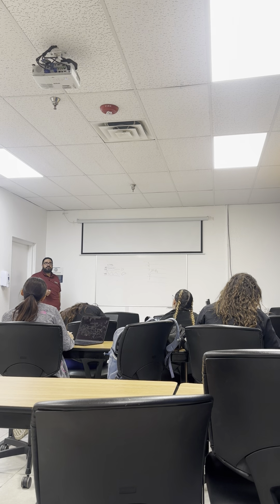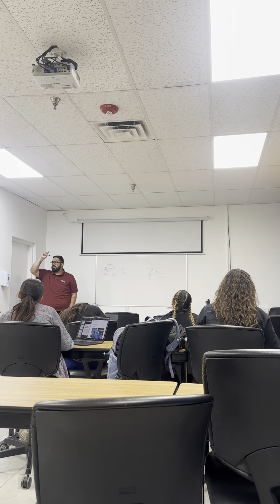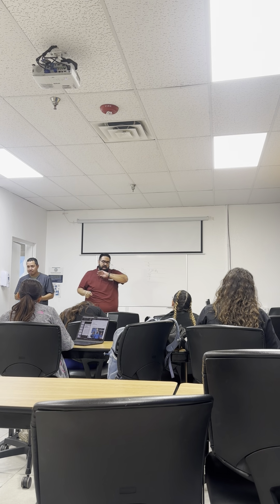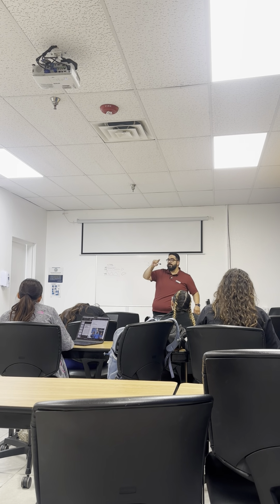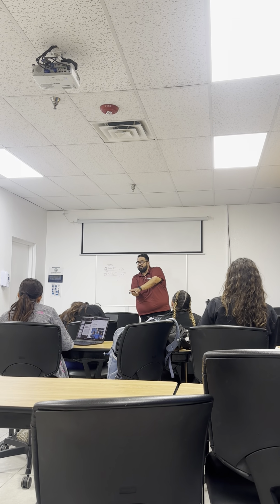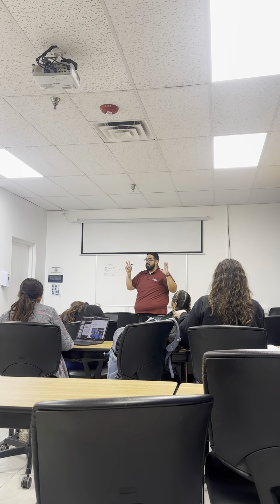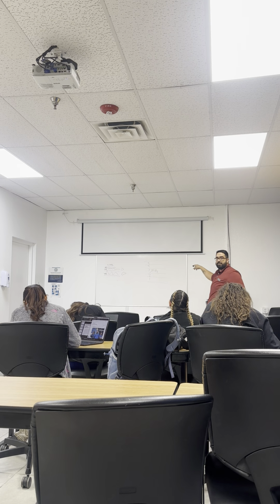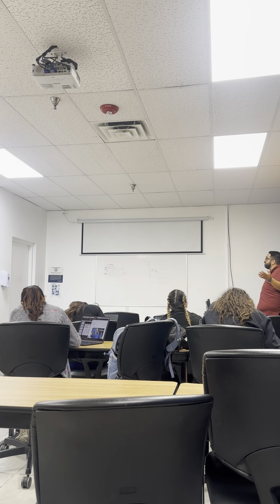Have you seen those artists where they draw, like, the old school, a line, and then they put that line aside, and then they put another color, and they put that one aside, and then another color, and then they put them on top of each other, and then it makes an image. That's exactly what the frequency and the spatial compounding are doing, just with different things. The spatial compounding is with different angles, frequency compounding is with different frequencies.